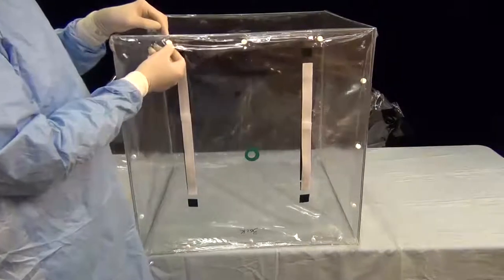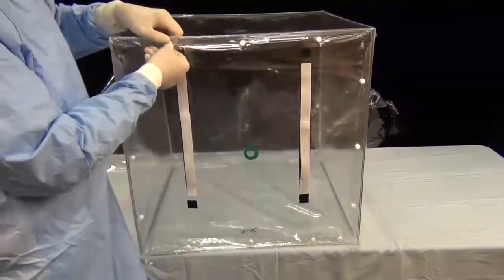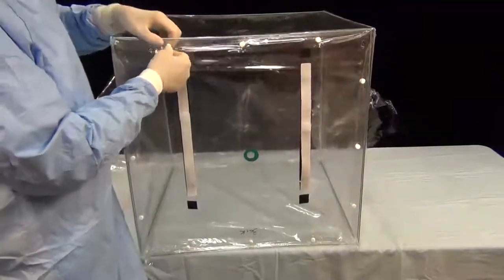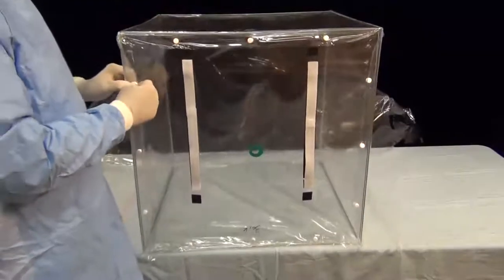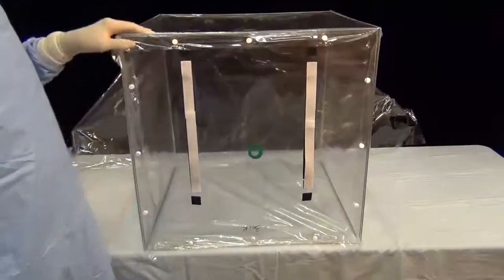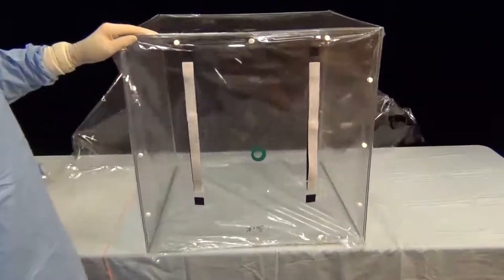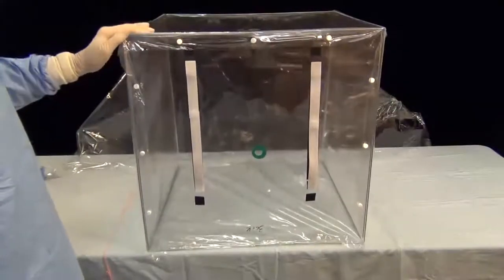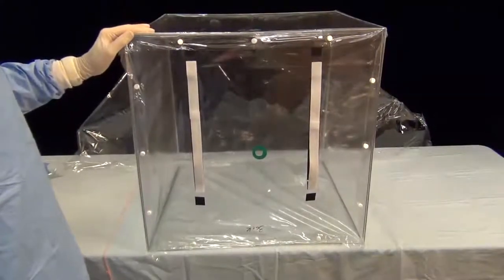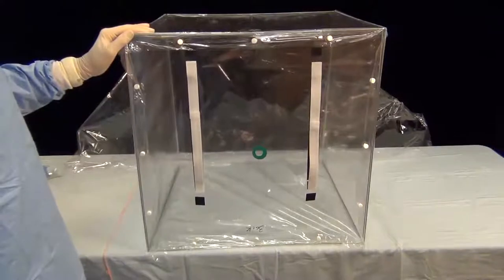And then just to complete it, I'm just going to complete these little clips up here. One. Here's another one. And that pretty much takes care of it. You now have pretty solid construction of the tent and the patient is now ready to be placed inside of it.